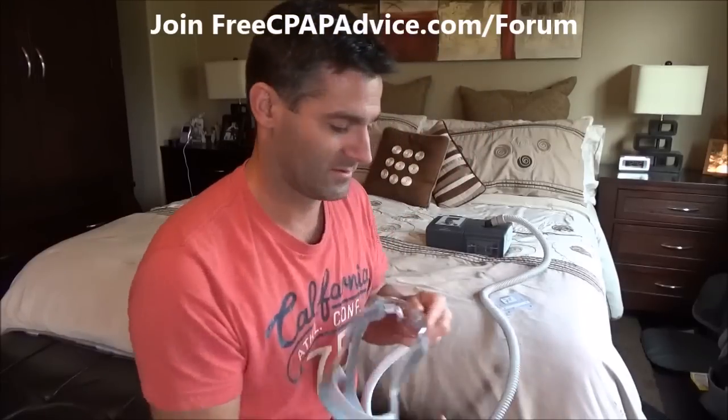Anyway, so you can see here, I'm like so far into the large category, I believe my nose may be too big for this mask. But that's another issue. One thing that the rep told me is if you happen to be on the line of one of these, what you want to do is actually go up to the next level. So you have a little more space. I found this to be true because my nose was actually kind of hitting, when I say kind of, I mean it was totally hitting the end of this, which was a little bit irritating for me. But I got it adjusted to the point where it was fine. So because of my large nose, I need to up the size. And that's as long as it takes.